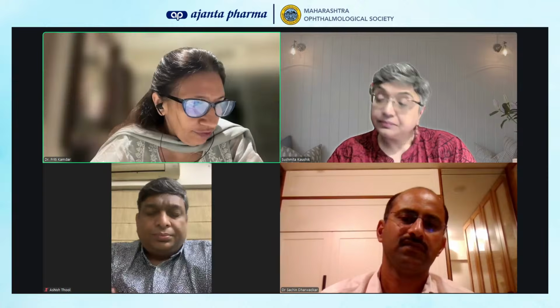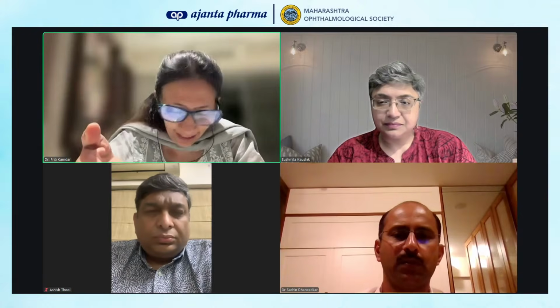Now, is OCT RNFL thickness reliable for assessing progression? Many patients are not able to do fields reliably, so in the absence of a reliable field, can you use OCT? Dr. Sachin, yes or no? Absolutely, yes, provided you get the right kind of images and you have the right kind of machines. I just showed the example of RNFL progression. Yes, you have addressed that question very well.